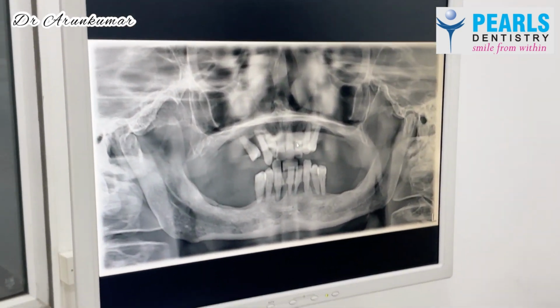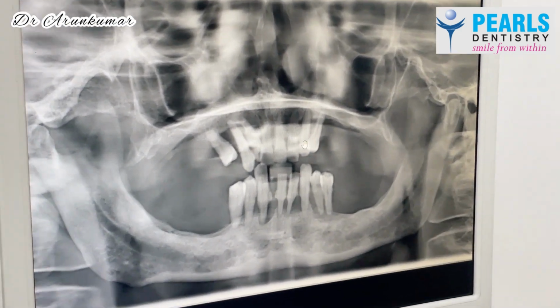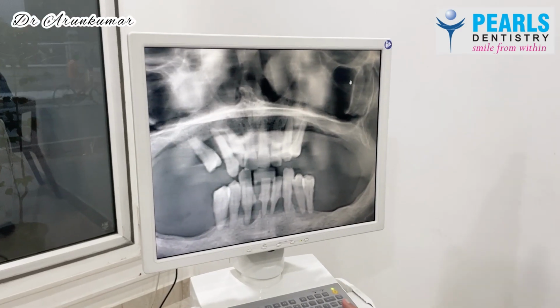So when it comes to dental implant replacement, and especially when it comes to full arch implant replacement for the upper arches, the upper arch is otherwise called the maxillary arch. So let's look at an example and then try to explain where zygomatic implants play a role. For example, in this particular patient, we are seeing very few upper anterior teeth remaining, and most of the upper teeth are having less than 20% bone here.